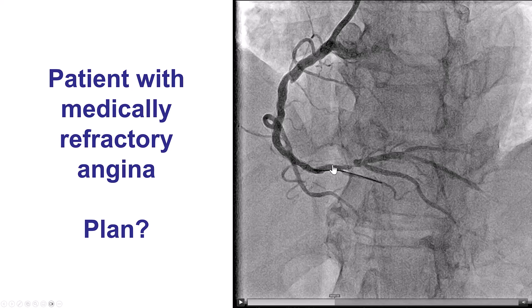The distal RCA lesion clearly needs to be treated. Our plan was to do physiology to determine whether the proximal lesion needs to be treated as well. As far as the plan for stenting, it's a 1-0-0. The PDA, which we call the side branch, doesn't seem to have significant stenosis. So our plan was to do provisional stenting, stenting from the distal RCA into the right posterior lateral.